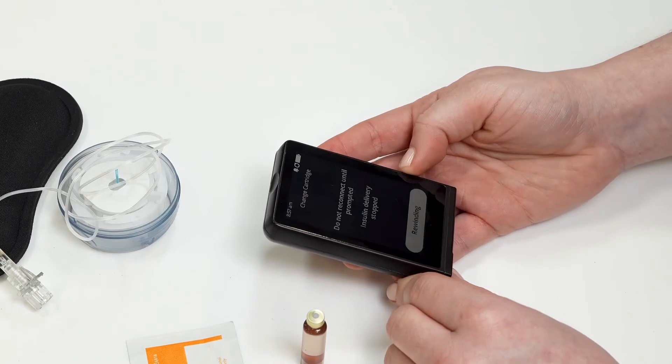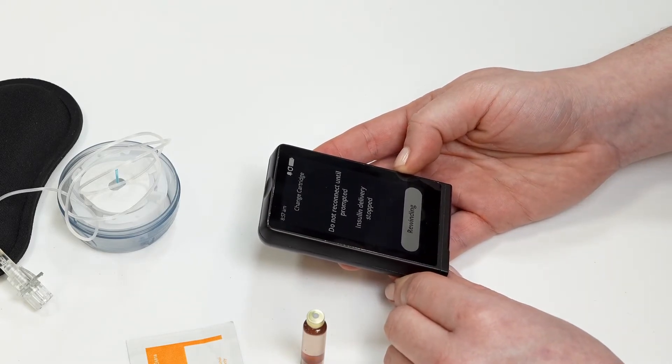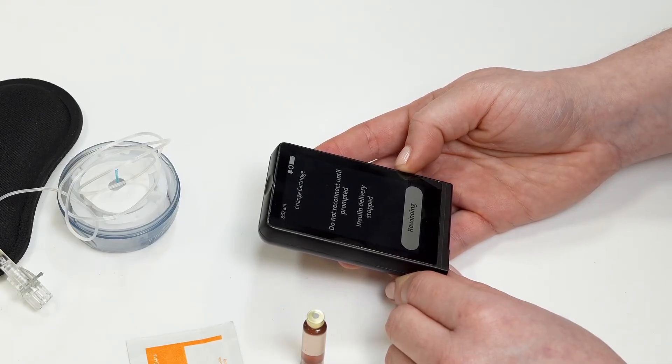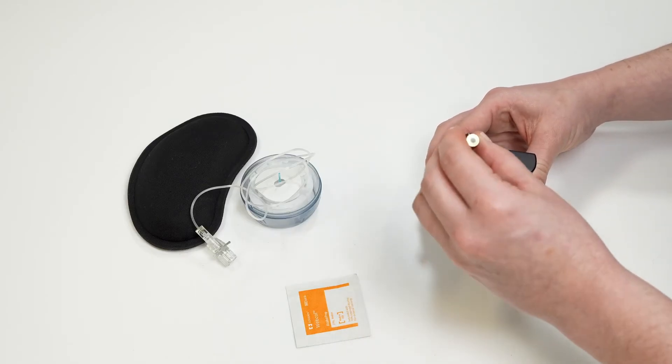Swipe the rewind slider to the right. The islet will rewind the device to prepare for the new cartridge. After the rewind is complete, insert the new filled cartridge into the islet.